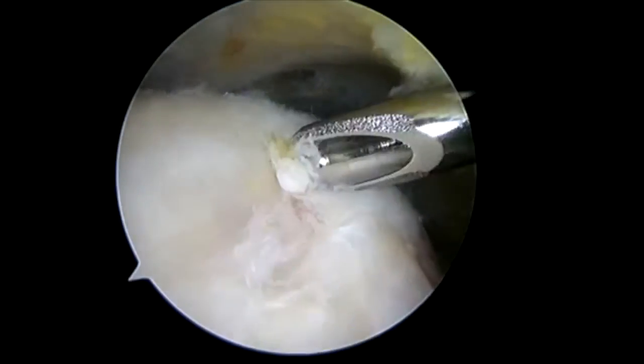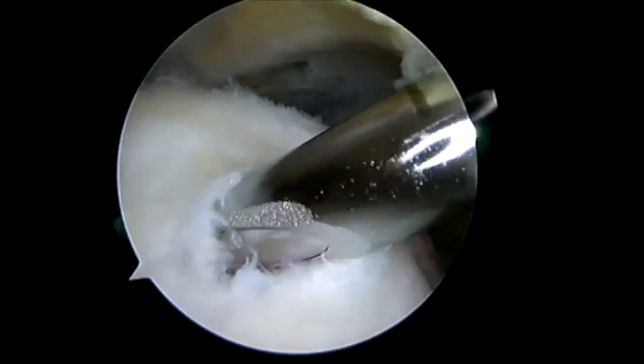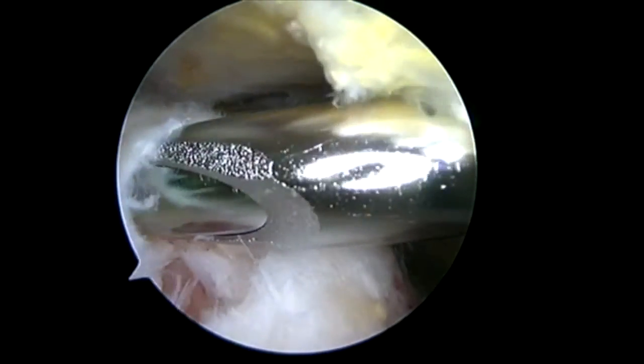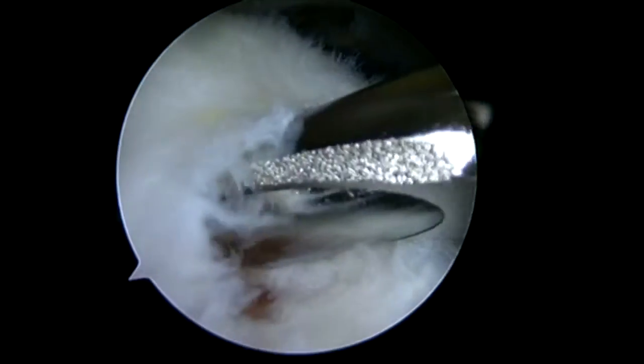The rotation patch is a bioinductive implant. It's designed to be laid on top of the rotator cuff tear on the bursal surface. This is utilized for the supraspinatus tendon.